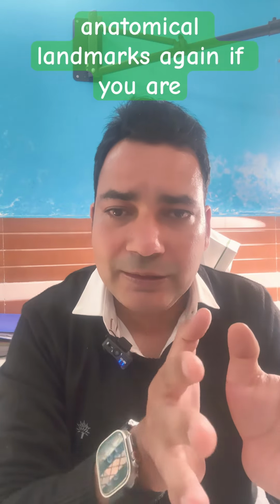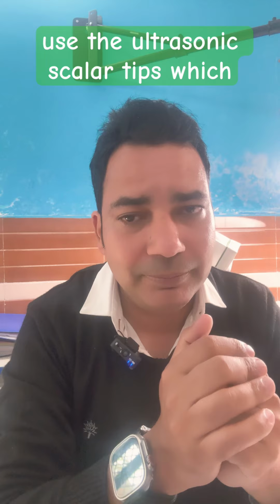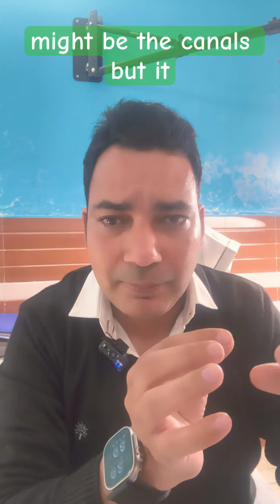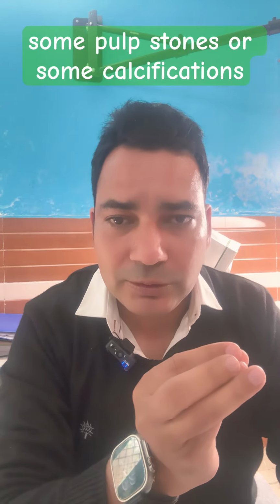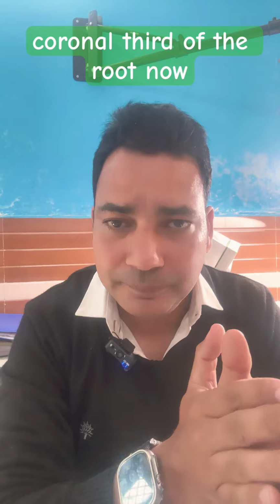Again, if you are still not able to locate the canals and you are certain that you are on the pulpal floor, you can use the ultrasonic scaler tips, which will help you identify that there might be canals, but they might have been obstructed due to some pulp stones or calcifications, which are mostly located in the coronal third of the root.